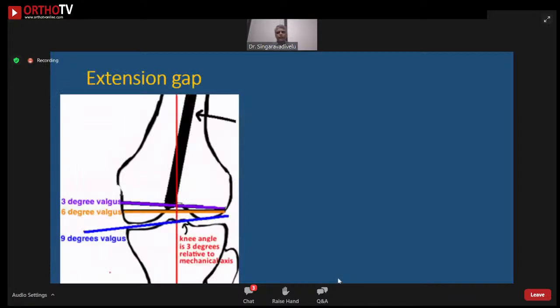As he has eloquently described, I will not go into detail: the proximal medial tibial and the lateral femoral, it is not perpendicular, it is 3-degree varus. So we are taking a perpendicular cut in extension. And we also know that for the tibial cut, we use an extramedullary jig to get a perpendicular cut. And for the femur, to get the mechanical axis right, extramedullary is difficult, so we use an intramedullary rod. We have already calculated the angle. Normally for a mechanically aligned knee, it is enough if you take a 6-degree constant. It can be 6 or 5 or 7 depending upon the surgeon, but we make it constant. So that is the idea.